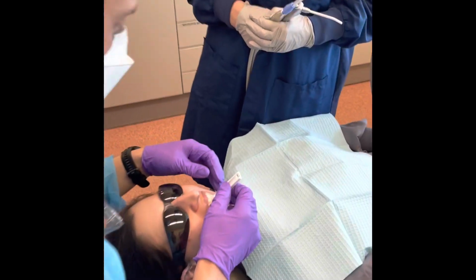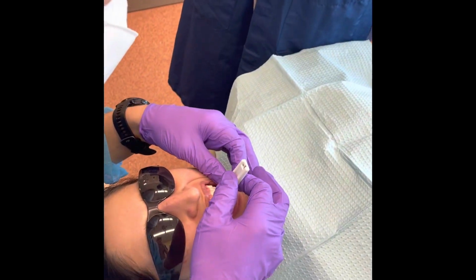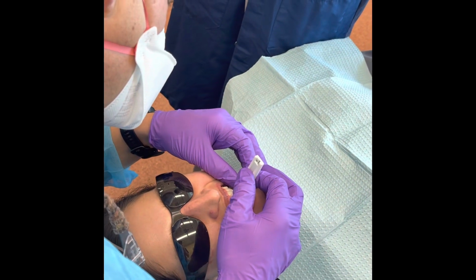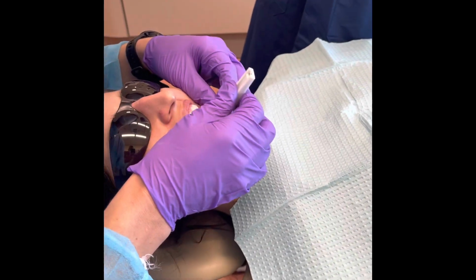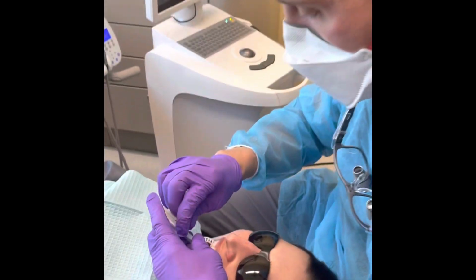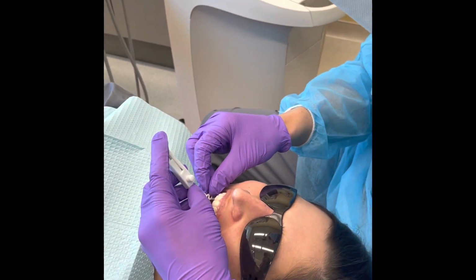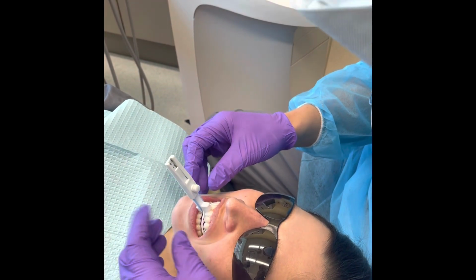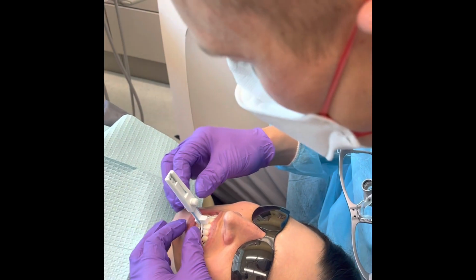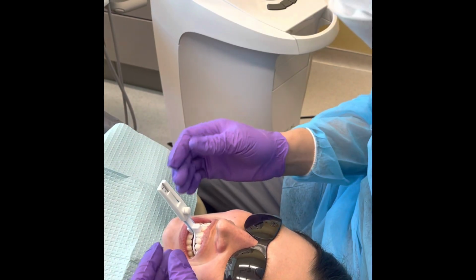So go ahead and slowly bring your lower jaw forward slightly for me. Bring your lower jaw back a little bit for me. Open a little wider. And let's try this one more time. What I want you to do, 1 second here. All right, go ahead and close down gently for me. Perfect. And so you look here, we're just making sure her lower jaw is symmetrical. We're not forcing her jaw one way or the other.